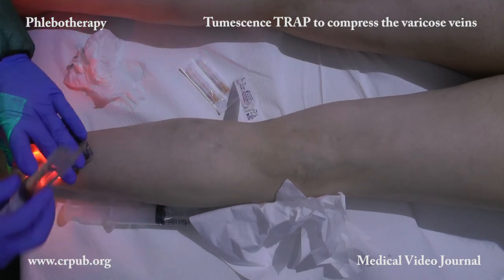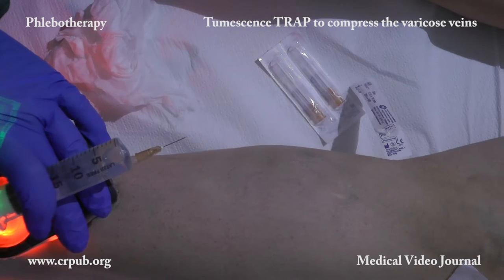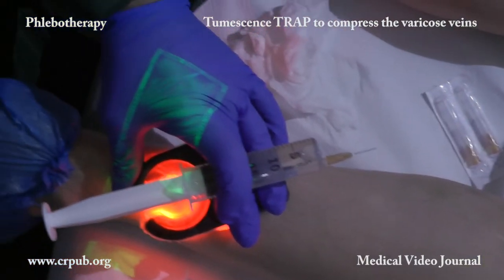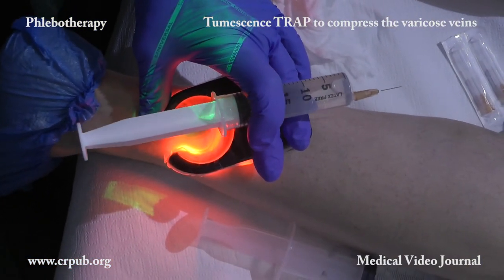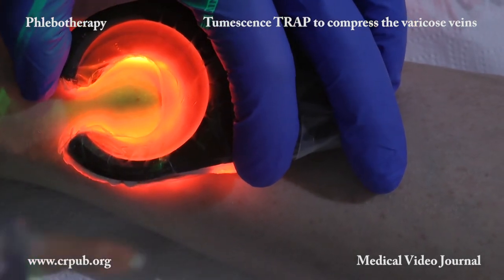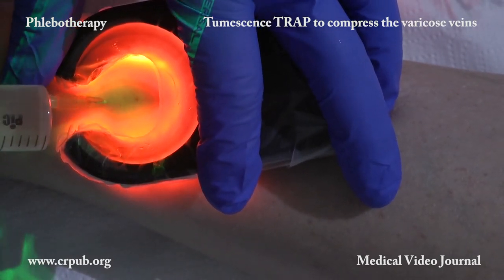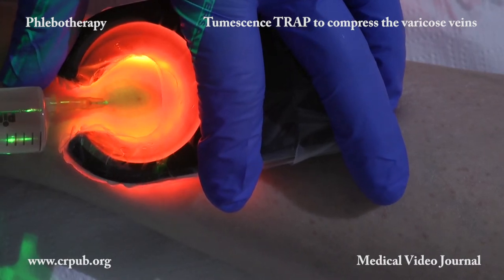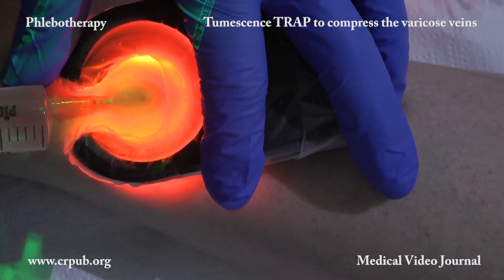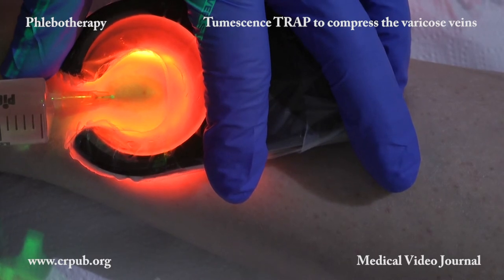Its action is three-dimensional, extending to the perforating, communicating, and superficial circulation. TRAP treats the hemodynamic hypertension of the venous circulation in the lower limbs. By using light that is close to infrared, we are able to locate the veins that constitute the gateways to the circulation. We inject a regenerative solution of 3% sodium salicylate in a buffered hydroglycerin vehicle into these gateways or visible vessels in sequence in the three regions of the leg: posterior, lateral, and medial.